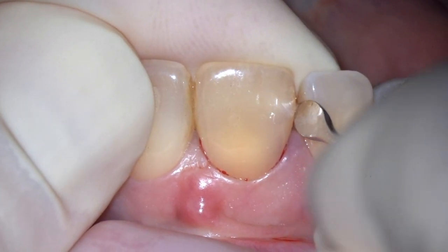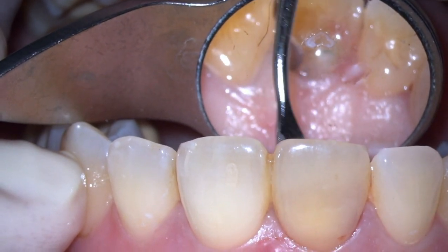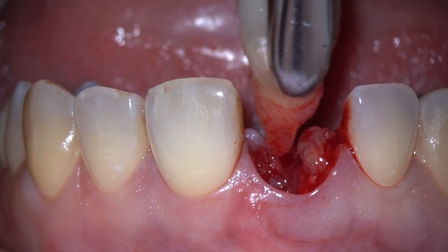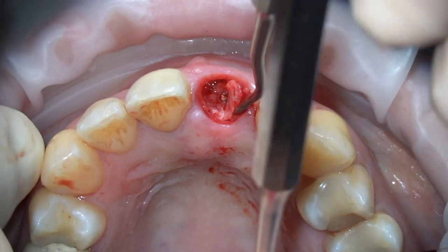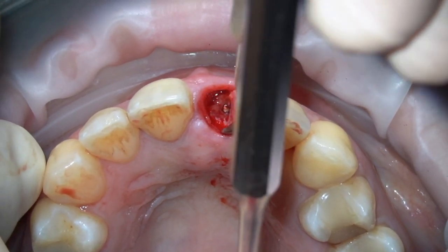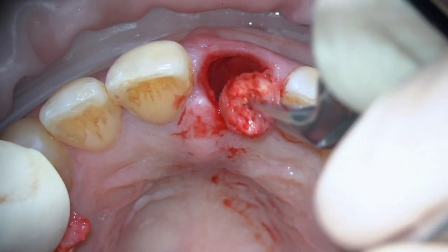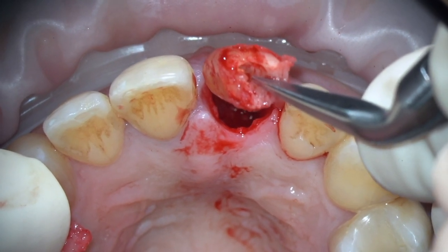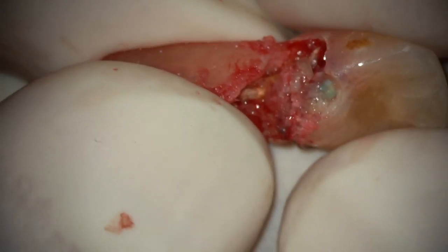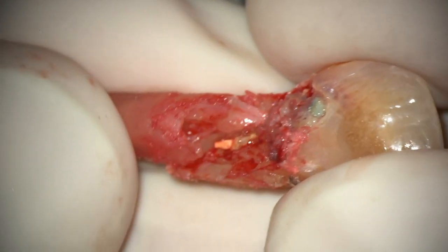Keep in mind that this tooth has internal resorption, so the chance of breakage is very high. First we separate the periodontal fibers, then we try luxation with forceps — and you can see here I already have a breakage of the tooth. Now I'm going to focus on extracting the apical part, continuing with the thin instrument to luxate the root. I grab it with a root pickup from U3D to remove the rest of the tooth. When I combine the two parts you can see the amount of internal and external resorption — obviously we are not able to save this tooth.